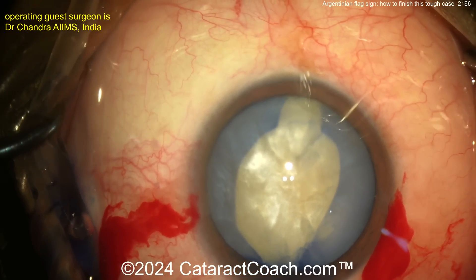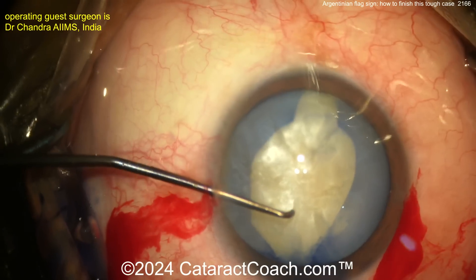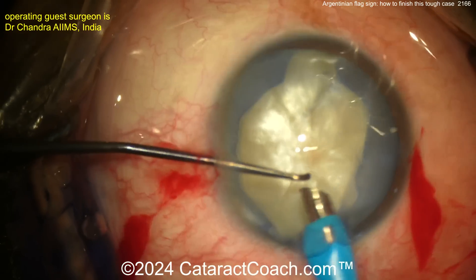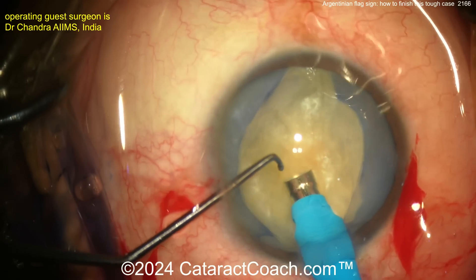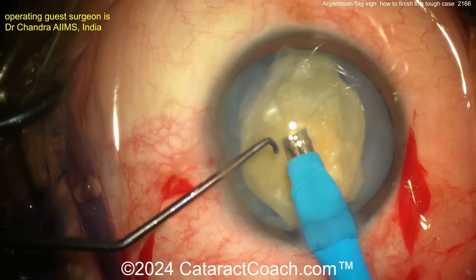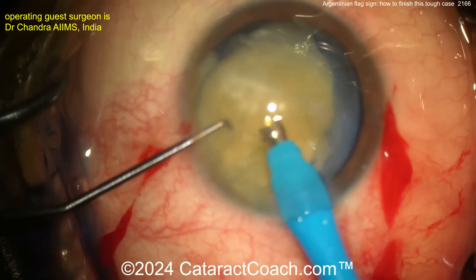Good news here: you do not need any hydrodissection. This intumescent white cataract has a liquefied lens cortex, and it's just going to be very mobile immediately. Coming in here with the chopper and the phaco probe — maybe grooving a little pit, a chop around, a nice little horizontal chop here.